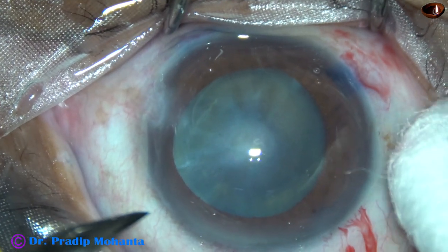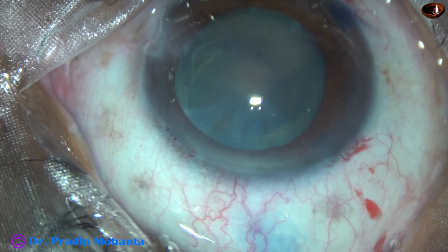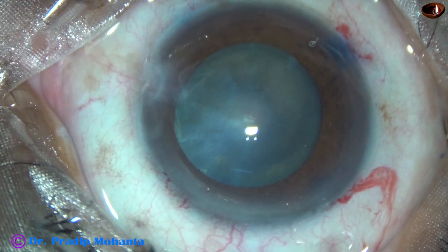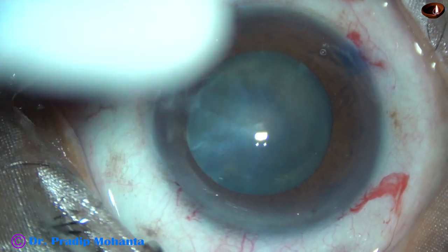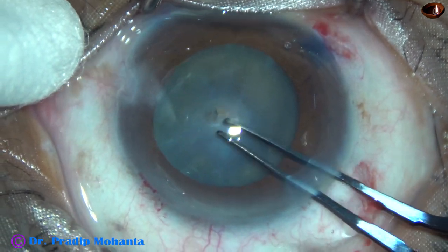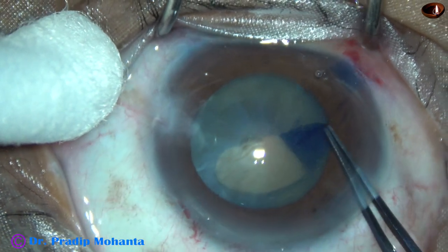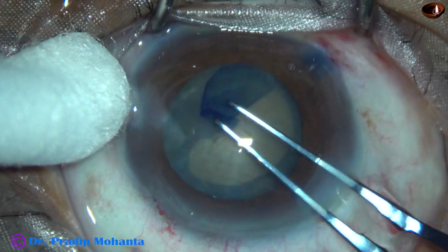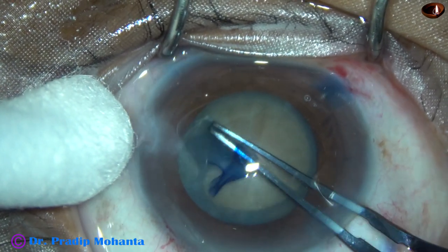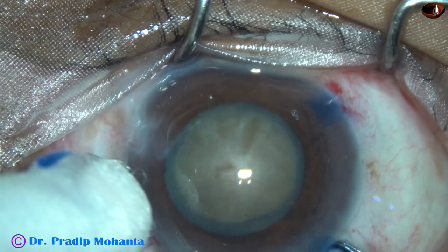One more side port on the left side of the main incision, about 3 o'clock hours away, for introduction of the chopper and bimanual irrigation aspiration cannulae. Watch capsulorhexis with utrata forceps. The utrata forceps goes in, the anterior lip of the main wound is lifted off, a capsular tag is raised, and the capsular tag is guided anticlockwise all around to get an adequate size rhexis. The pupil has dilated to some extent by adrenaline, and we have got an adequate size rhexis of about 5.25 mm.